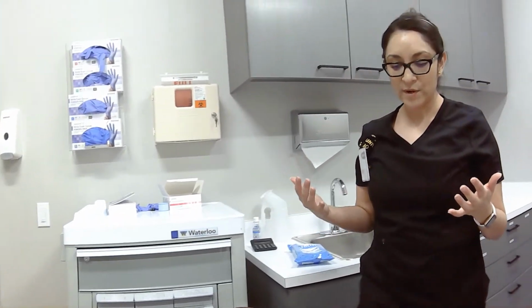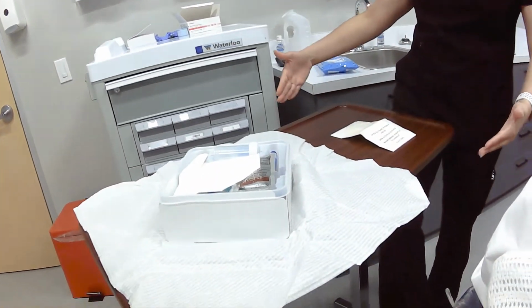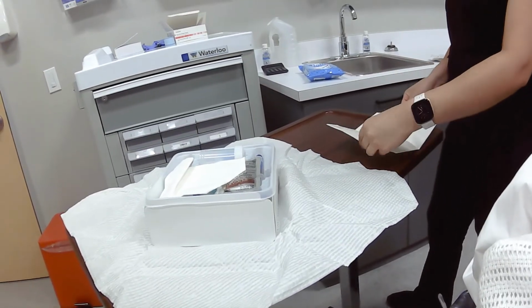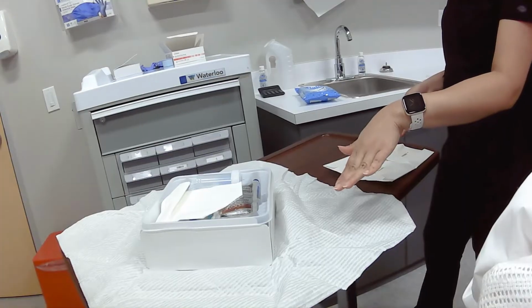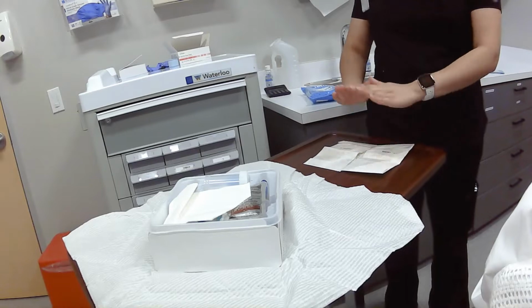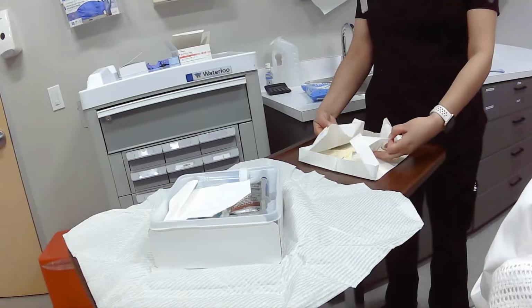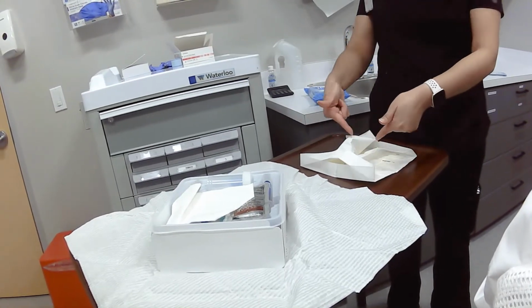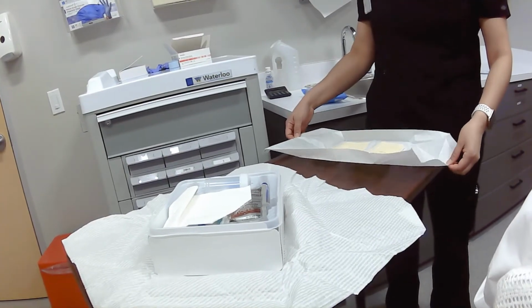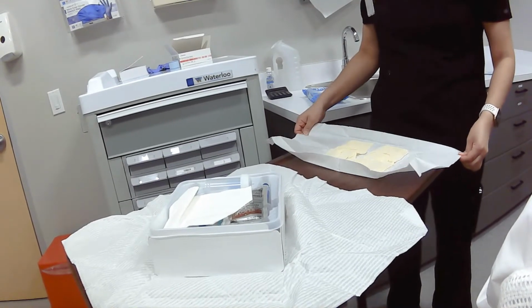Alright, so I am going to move this table to adjust it so that way I can use this portion of it to open my sterile gloves. Because if I open it this way, I am going to contaminate the sterile field. So that's a big no-no. We would have to start over. So I am opening it up like so. And you want to open it kind of like a book. Okay, your wrapper here is going to have 1-inch margins also. So again, you can touch the 1-inch margins with your non-sterile hand. Once you are sterile, you cannot touch those margins.